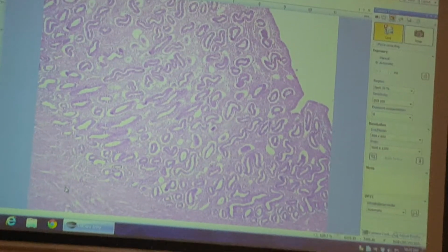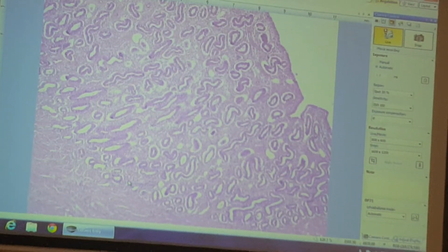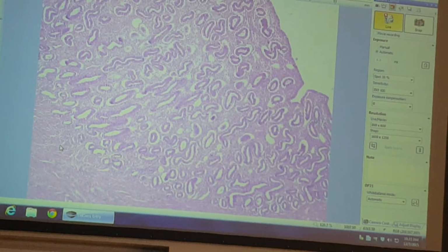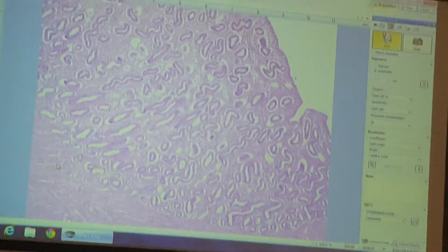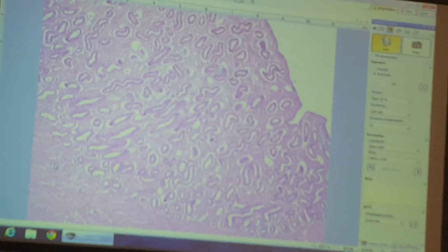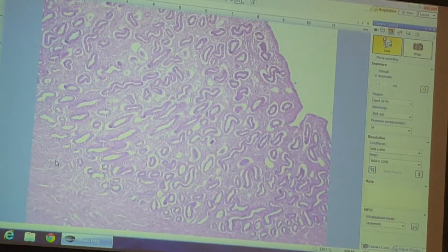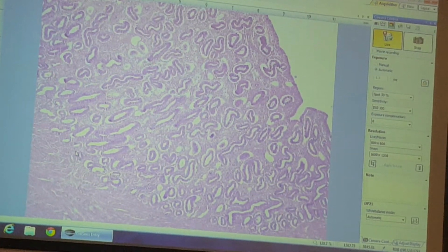Correct. Only the uterine tubes would have cilia. The uterus would not have cilia. That's correct. Okay? And again, name this organ. Uterus in the proliferative phase. Or proliferative uterus would work. Doesn't matter the order. Proliferative phase again is days 6 through 14. This is before ovulation, where the glands are rebuilding.